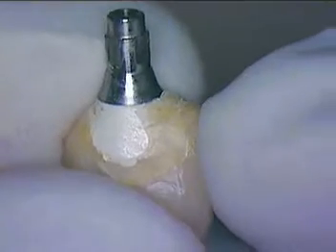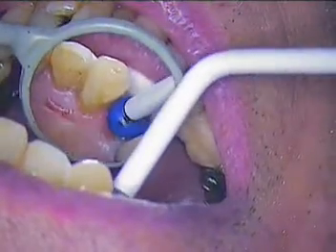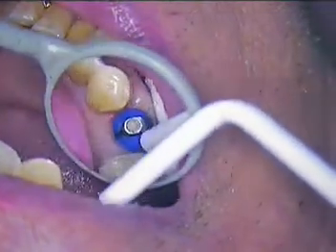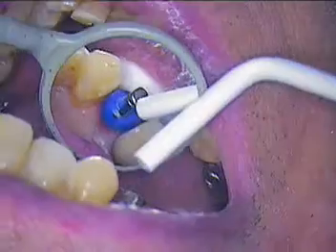I may end up polishing this a little bit before we reseat it. So here we go. We have a little bit of irritation still, and that's probably because this was over-contoured somewhat. It seems to be doing a little bit better right now. Let's see if I can continue to dry that out. We won't do anything — let's just see if it stops.